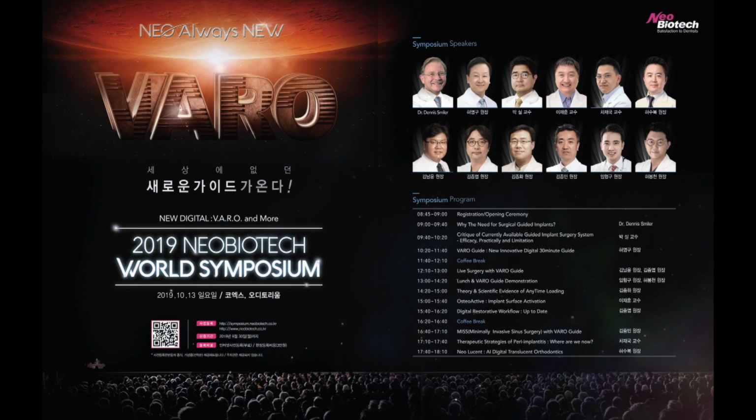Today I want to introduce a very special event which happened on October 13, 2019 in Seoul, Korea. There was the Neobiotech World Symposium. I was supposed to do the live surgery, but there was a change in the middle of the surgery. So you will see maybe the world's first live patient implant placement by the patient himself. From now on, I'll show you the full clip which was taken from one of the participants on the podium.